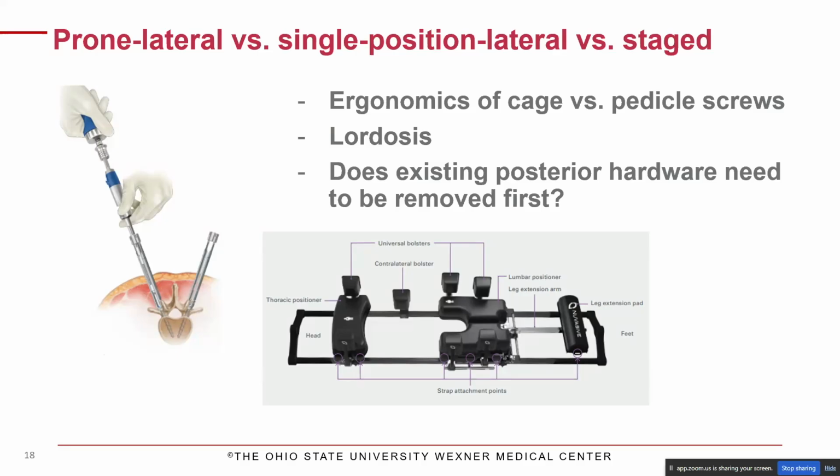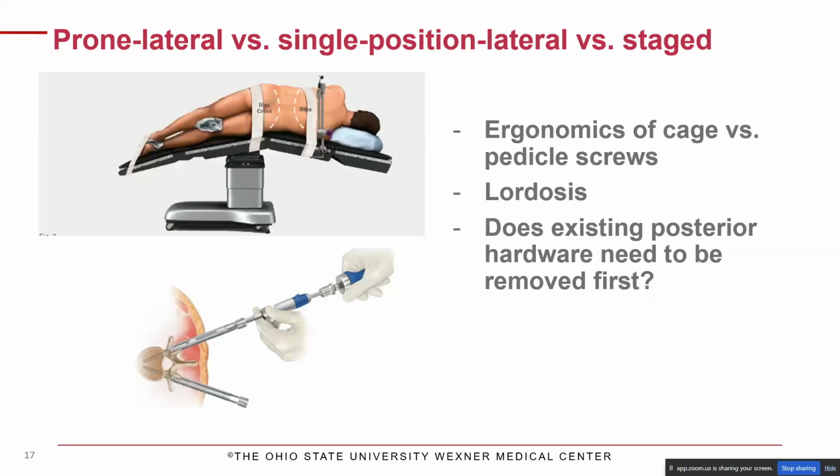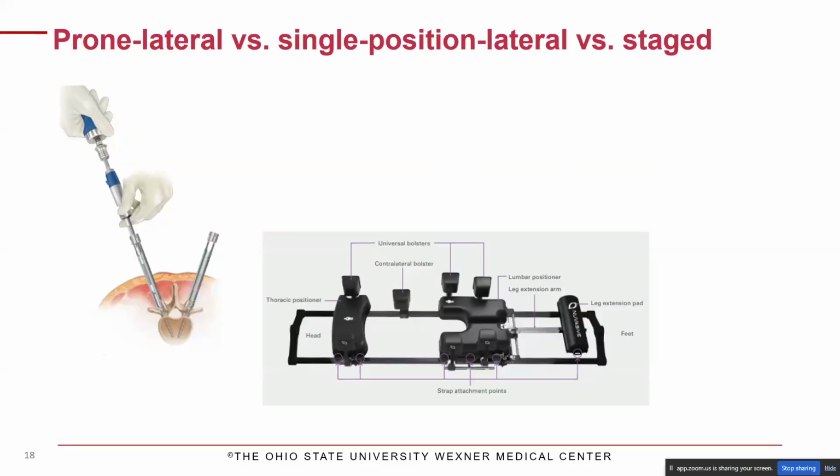And finally, there's the staged approach, where you do both. So first, you position the patient like this, you place the lateral cage, and then you flip prone and place screws. And I think that's actually probably the most common practice right now in general.